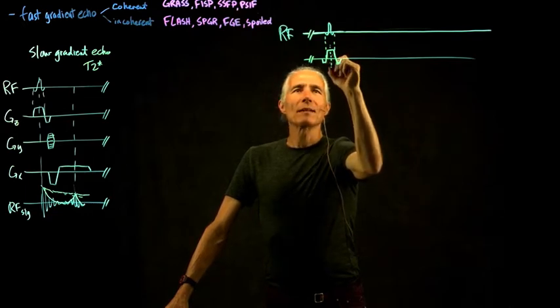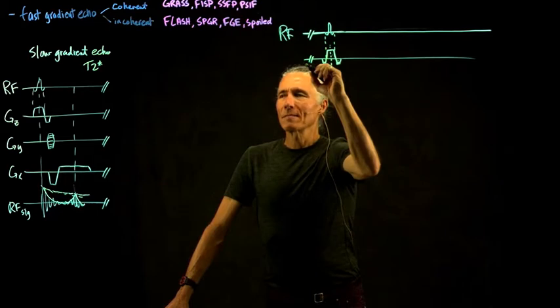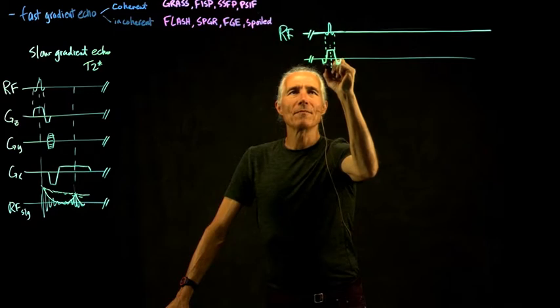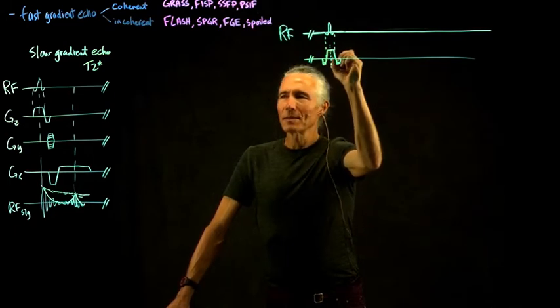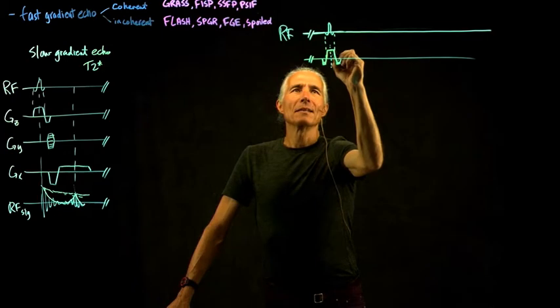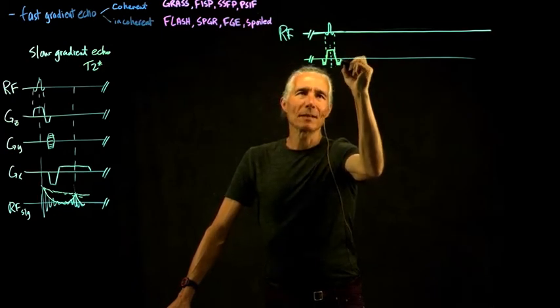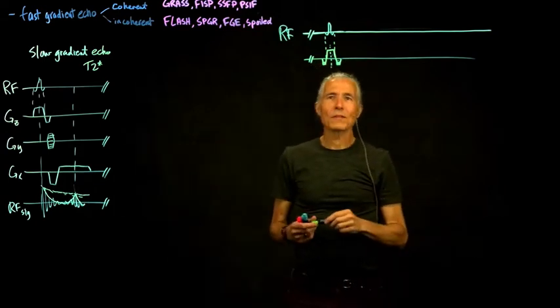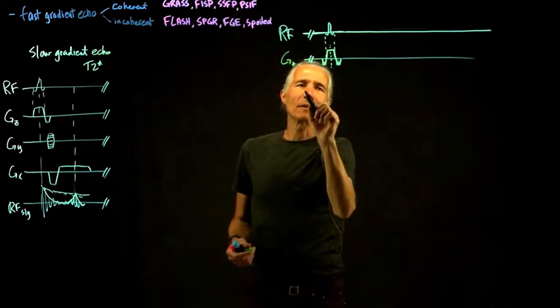But then we've got the first half before the RF pulse started. And so that one's going to mess up any pre-existing magnetization, mess up the phase of it. And so what we do is we prefix it, and then this one cancels out this. Then the RF pulse conventionally starts. Then we mess it up because we have to do slice select, and then we fix it up again. So that would be the slice select direction.